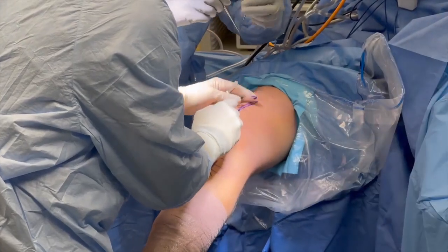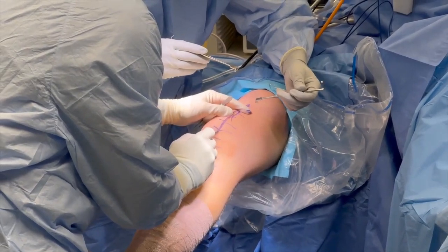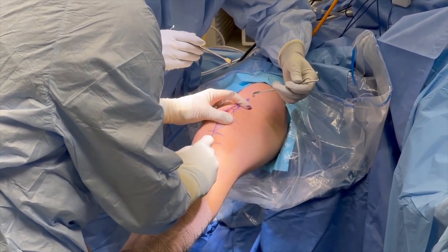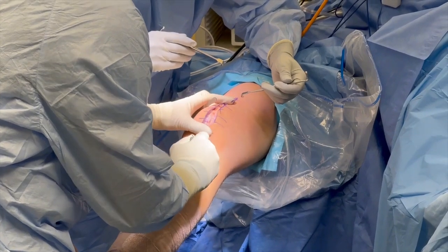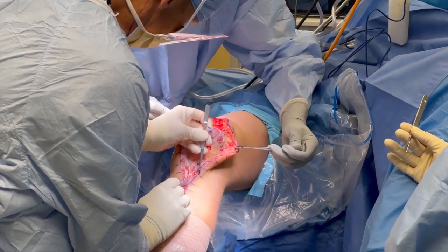An anteromedial incision is made over the previous knee incision, but usually occurs at the midpoint of the vastus medialis oblique muscle to just distal to the tibial tubercle, splitting the distance between the anterior tibial crest and the posterior medial aspect of the tibia. Dissection is then carried over the medial aspect of the tibia.